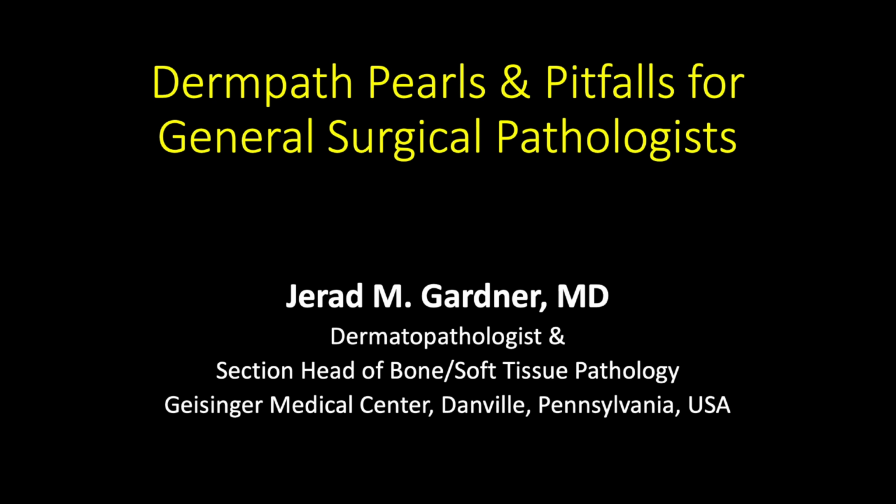I'm going to just do a whirlwind tour of some various Dermpath pearls and pitfalls aimed at general surgical pathologists, i.e. non-dermatopathologists, some of the stuff that I see people commonly struggle with or be frustrated with. So we're going to try to cover some of those. Obviously, we only have 40 minutes, but I'm going to do my best to get through all of these.